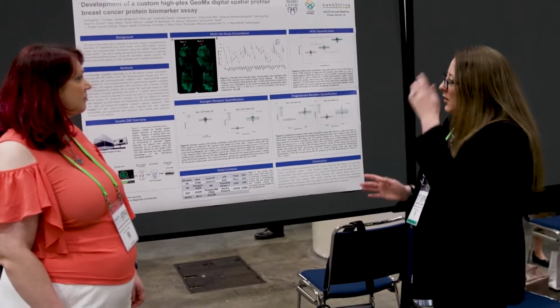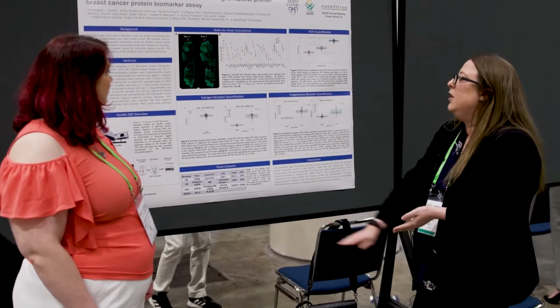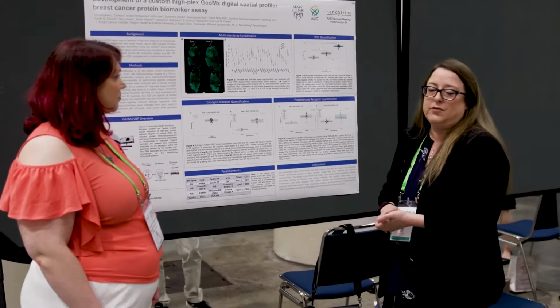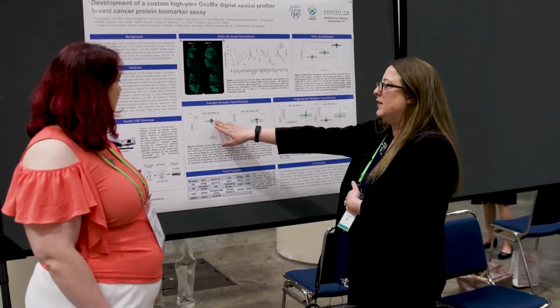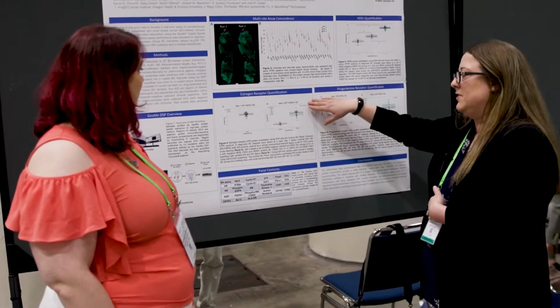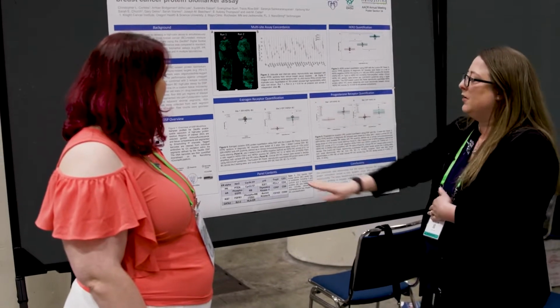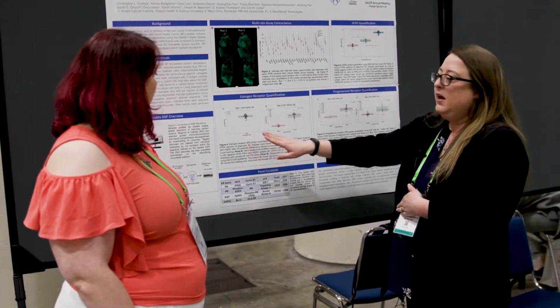The same was done for both estrogen receptor and progesterone receptor. So the 2 different sites had 2 different clinical cohorts. One was all ER positive and then HER2 negative, and then another one was both ER positive and negative and then HER2 positive. So here you just see that they're all ER positive.